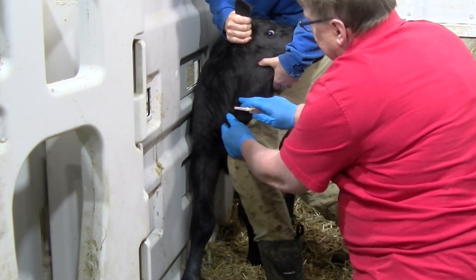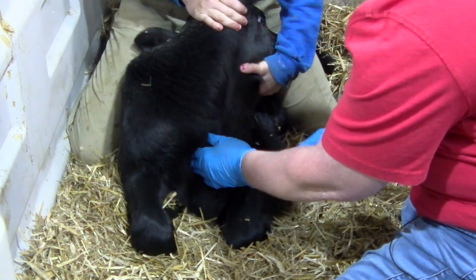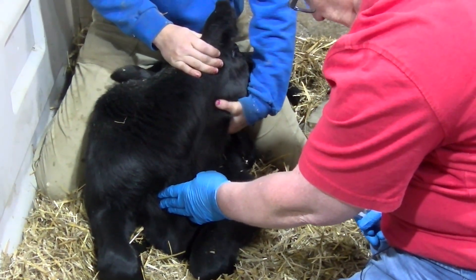When performing a jugular blood draw, you can restrain the calf in a standing or laying position. In this video we will demonstrate both ways of restraining a calf.